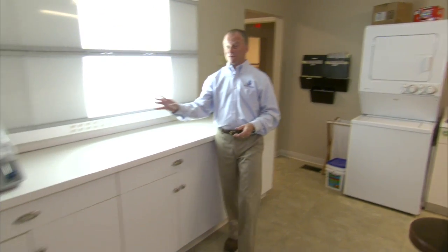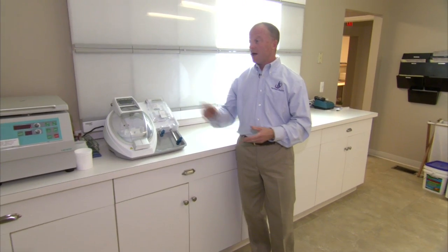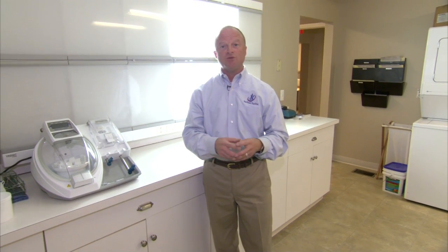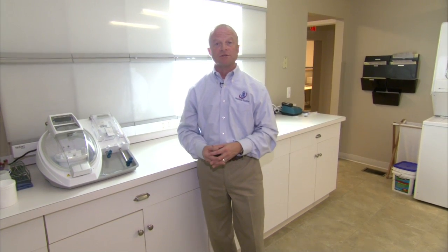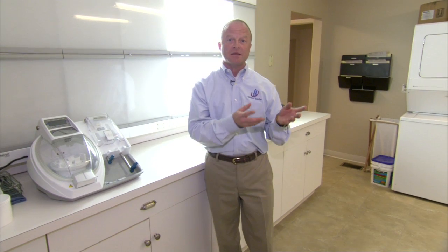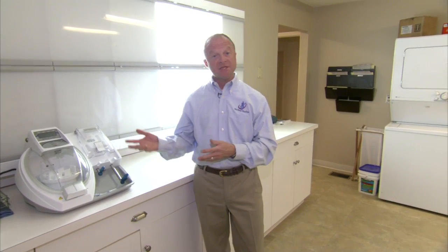Over here we have something really cool. This is some of the latest in technology that we're using on the horses. It's IRAP and PRP. And basically what we do is we take a blood sample from your horse and we spin it down and draw out very special portions of the blood work, and then we inject it back into your horse. And what this does is it helps to treat conditions that affect their soft tissues, their tendons, their joints, and it helps to decrease inflammation and make them healthy again.